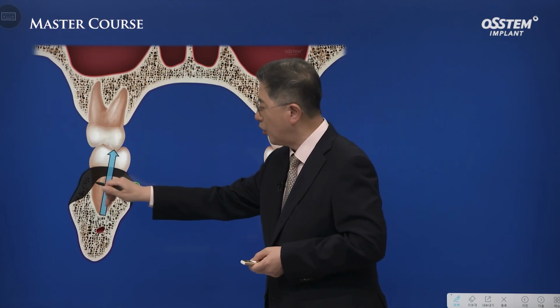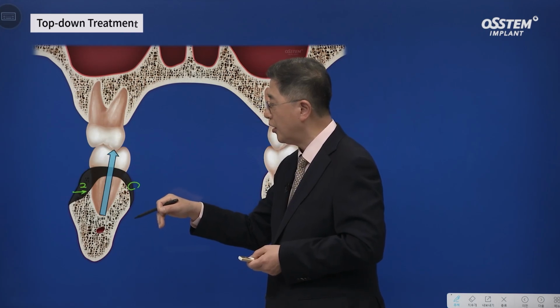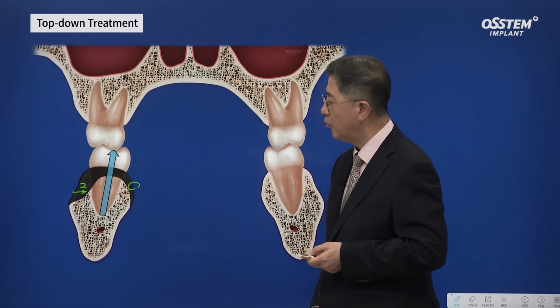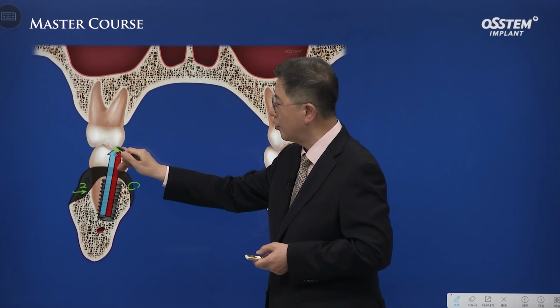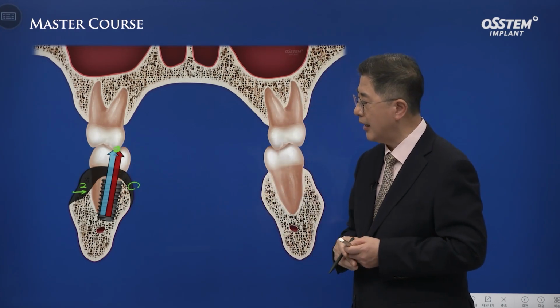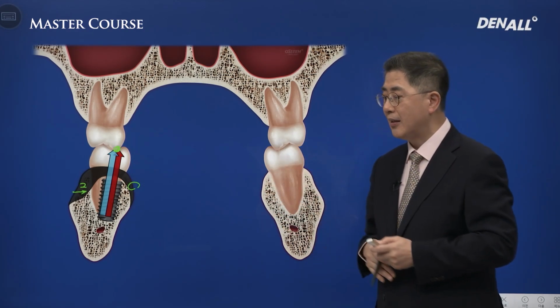Considering bone resorption patterns where the buccal bone resorbs twice as fast as the lingual bone, if you place implant after 6 months, it tends to shift inwards compared to the natural tooth's axis, which initially points towards the maxillary palatal cusp. This is due to central positioning of the implant taking into account the bone loss.